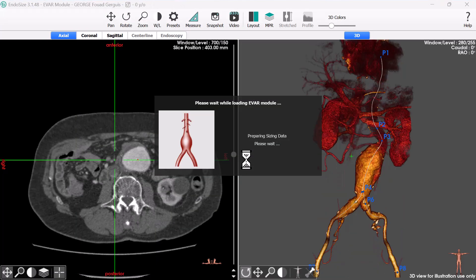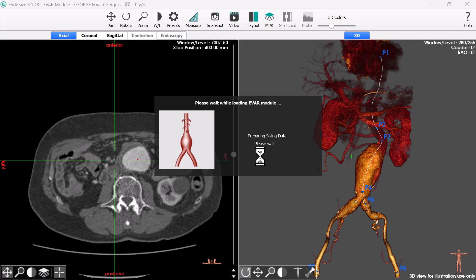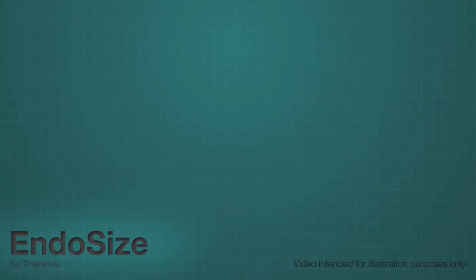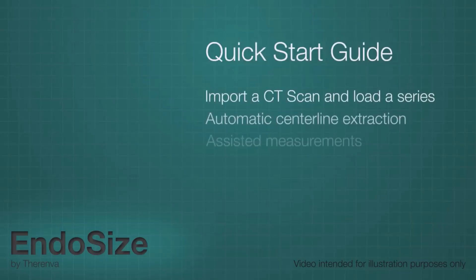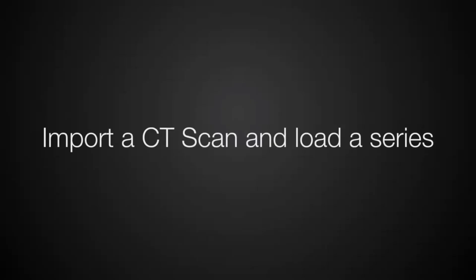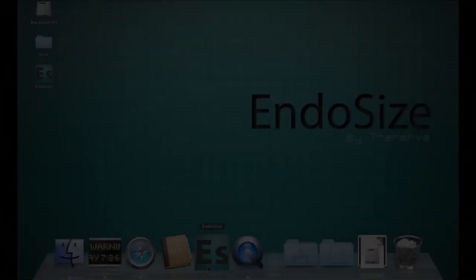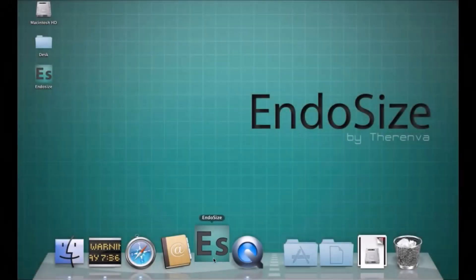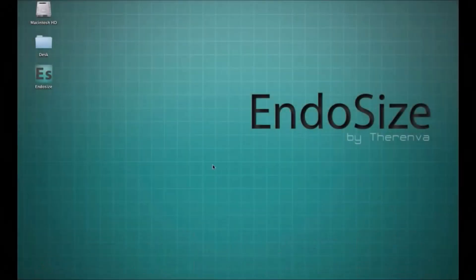And here you have a beautiful view. So here is a quick guide to using EndoSize, which is a great video. You import the CT scan from either folder or PAC system.